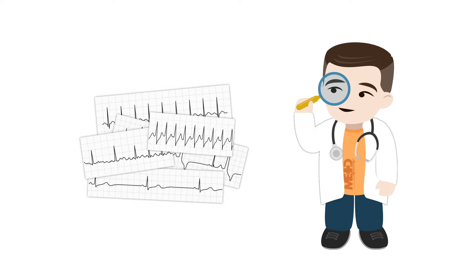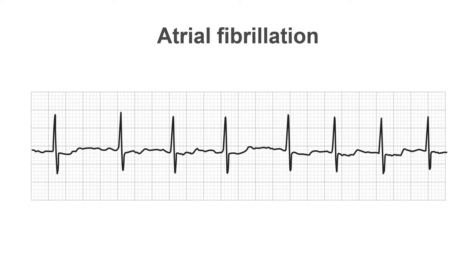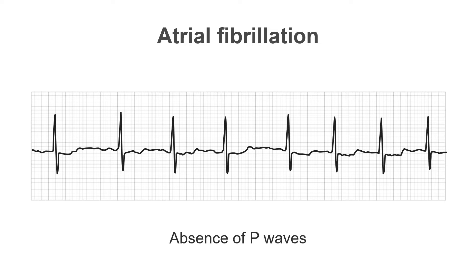When you analyse a Holter recording, there are some arrhythmias that you'll encounter commonly. Let's take a look at some of those now. The most common sustained arrhythmia we see on Holter recordings is atrial fibrillation. It's identified by its irregularly irregular character and by the absence of any discernible repeating P-wave activity.